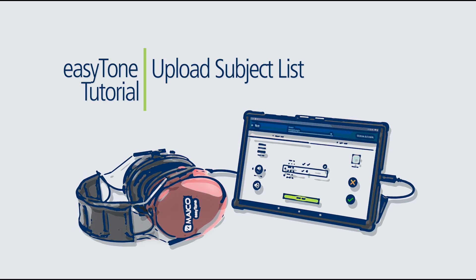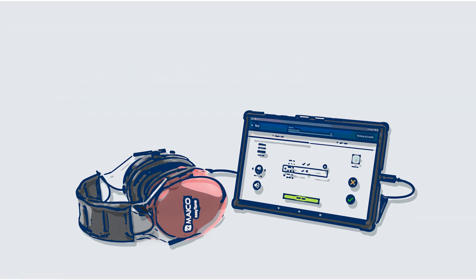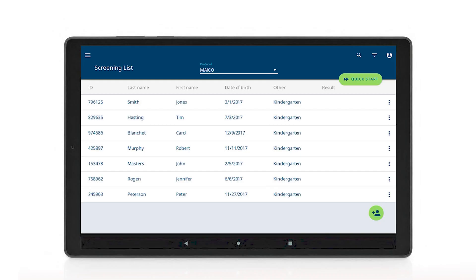This tutorial is to show how to upload a subject list to the EZTONE app using the EZTONE companion software.